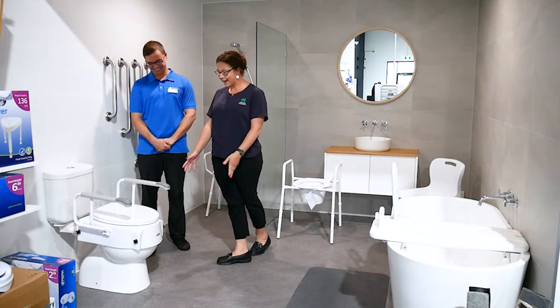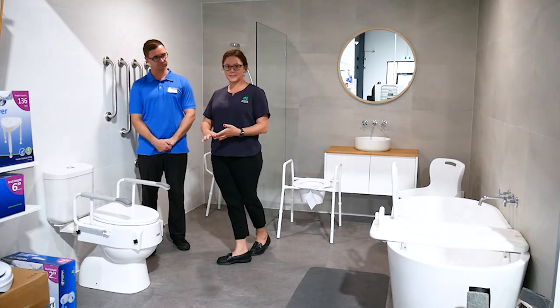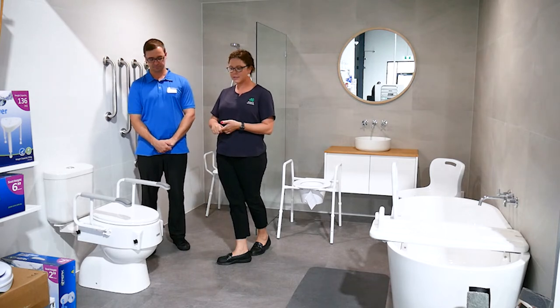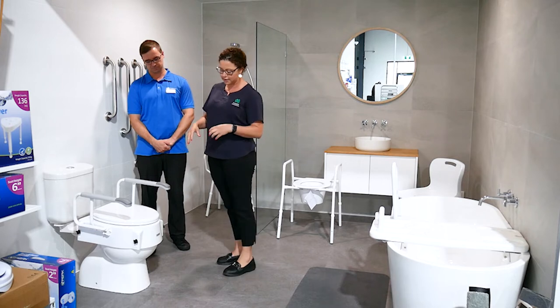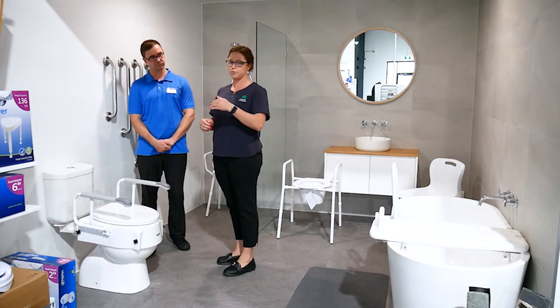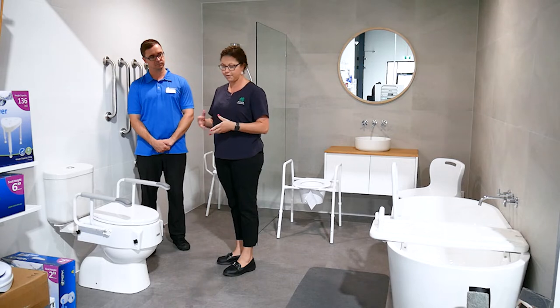I really like this one. Opposed to some of your 4, 6, and 2 inch toilet raisers which are very specific, this particular one you can actually adjust. So this one you can have 50mm, 100mm, or 150mm above the toilet.